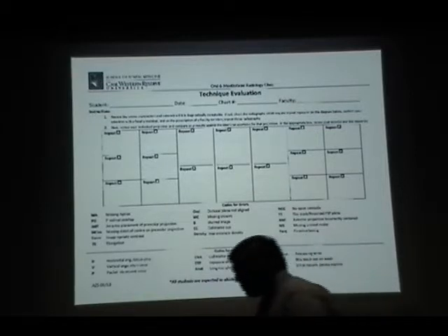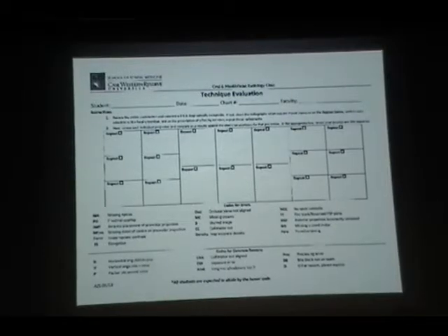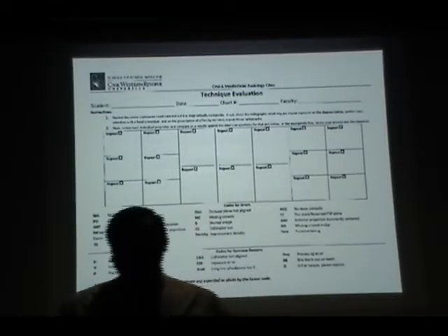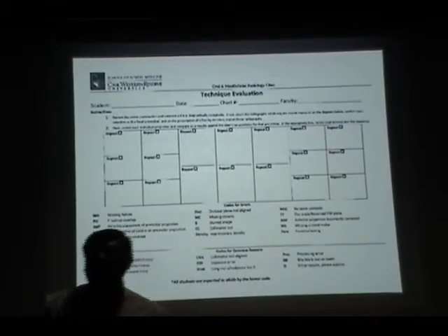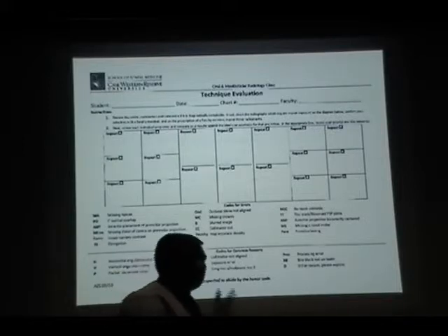And say for instance, if you take 24 and you submit this as a competency, what I do is look at the number 24 and say you failed. Even if you could have done the best full mouth series, I will not look at it, because you did not fulfill the protocol of not exceeding the retakes. Max 5. And for bite wings, max 2.